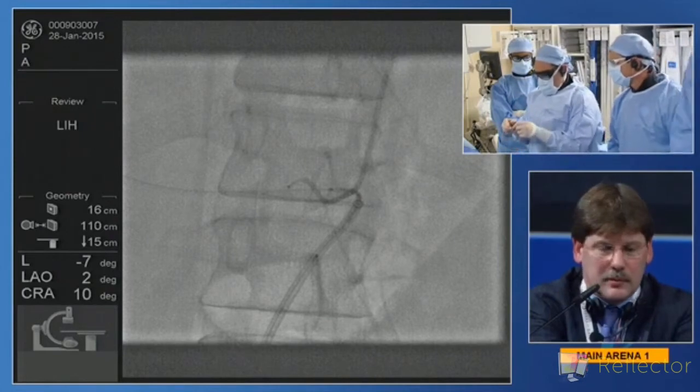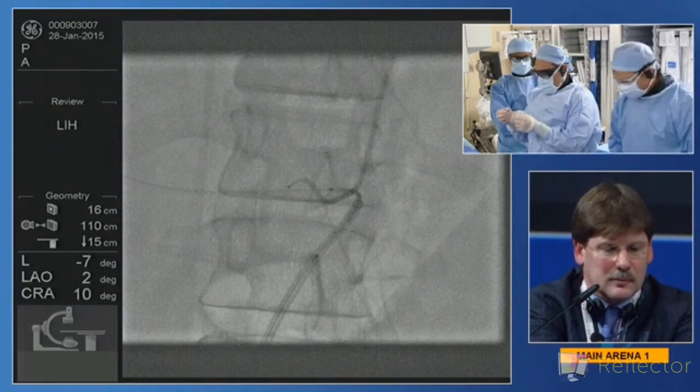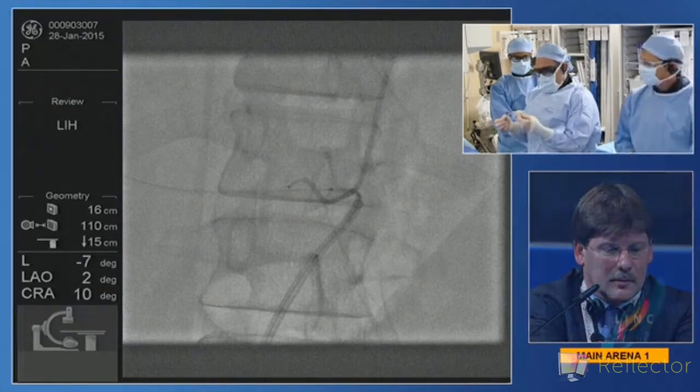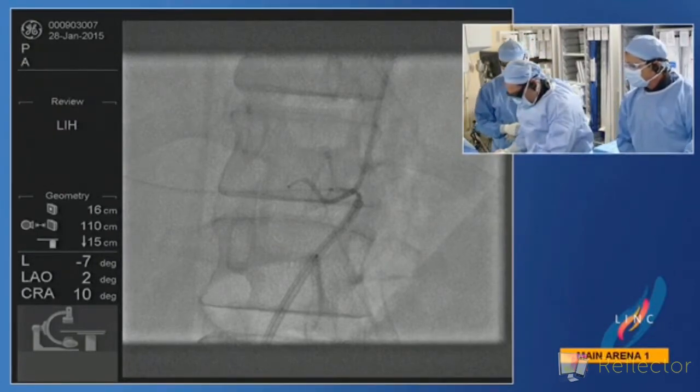So they're ready to make a quick turn here into this splenic and get their micro in place, at which point I've got a 6mm Viabahn, which I'm going to put into the common hepatic. We'll go lateral, and we'll complete the ostium probably with an iCast, as Peter suggested.